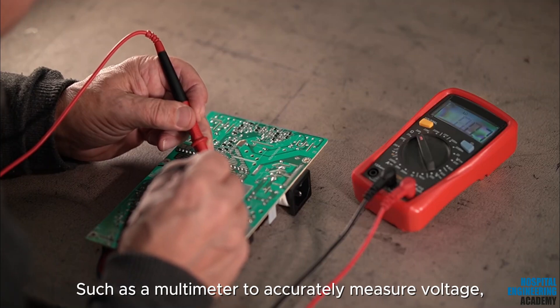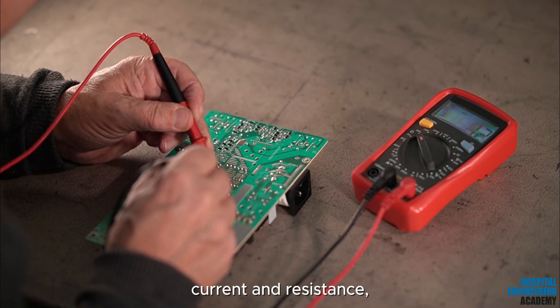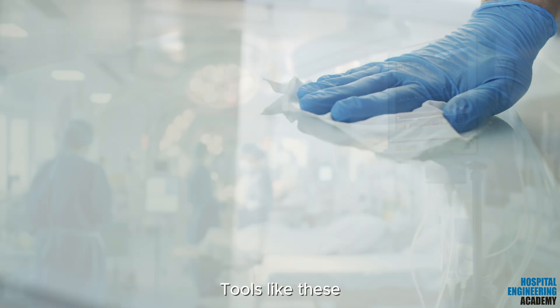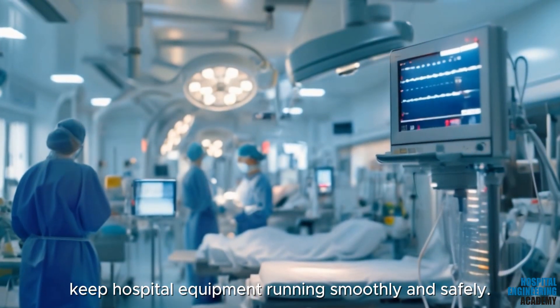Tools such as a multimeter to accurately measure voltage, current, and resistance, or cleaning supplies to keep everything spotless — tools like these keep hospital equipment running smoothly and safely.